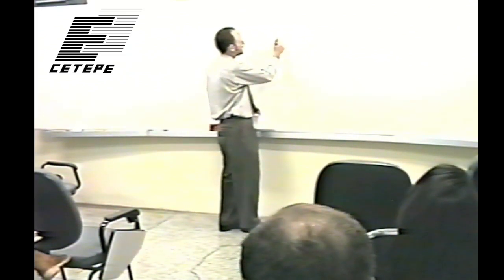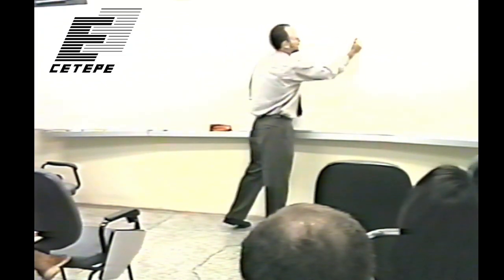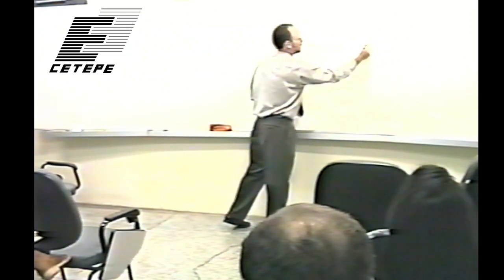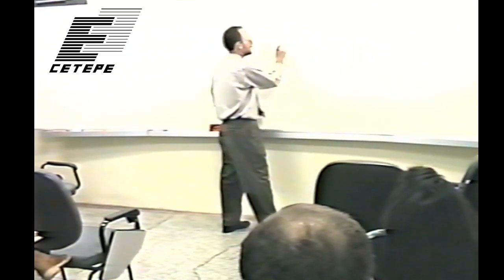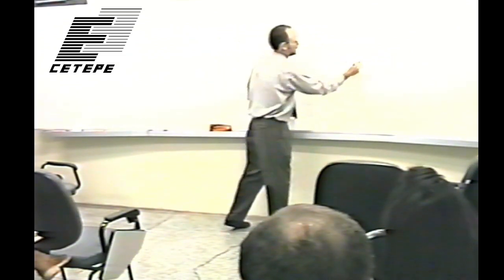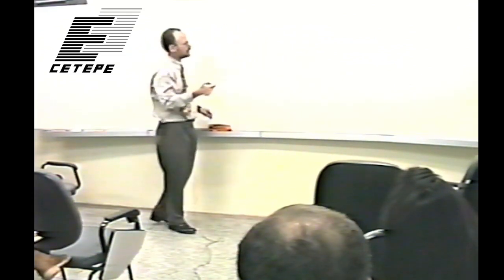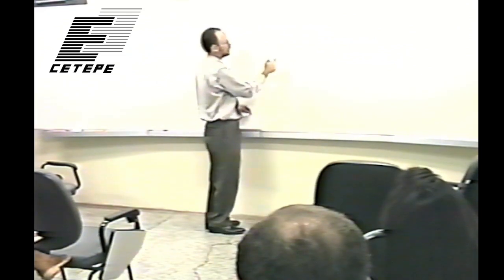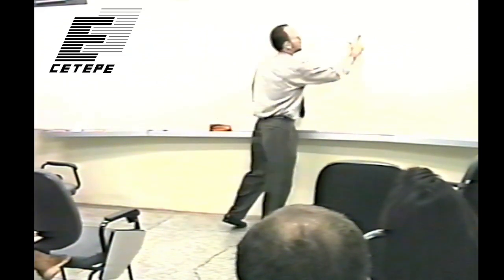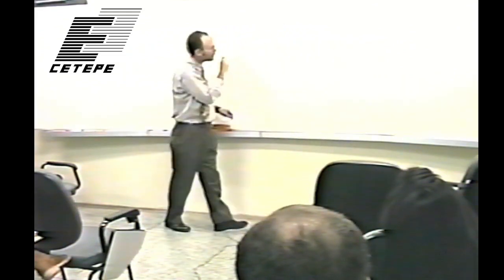So then what they do, and the reason you talk about film screen systems, is that you put a screen at least on one side, and almost always on both sides of the film. I meant to draw this: the top screen is thinner, and the bottom screen is thicker.